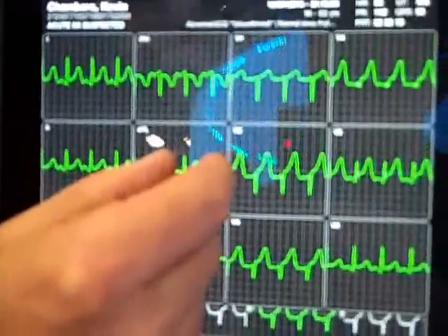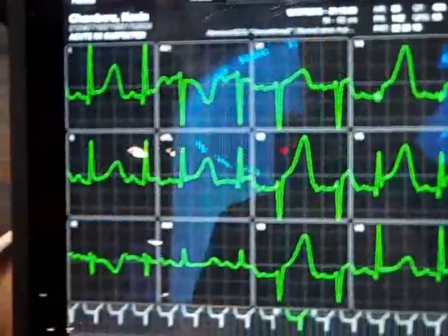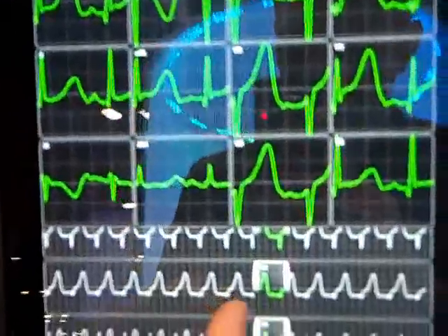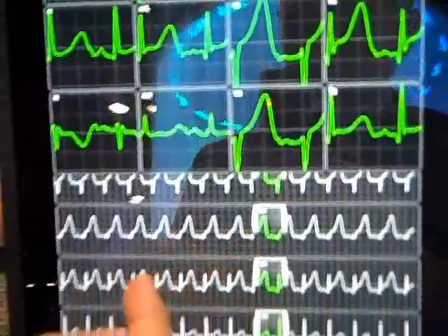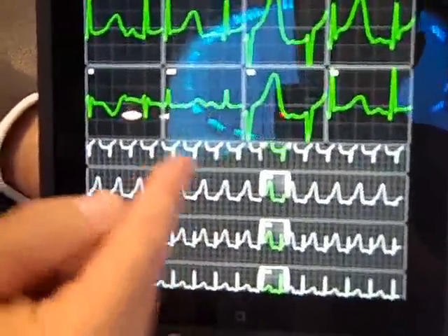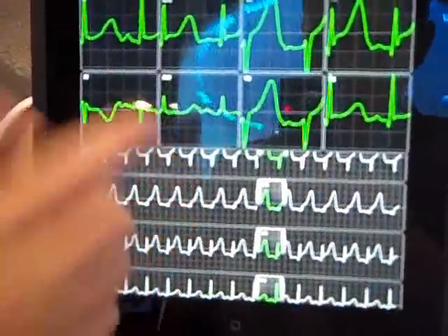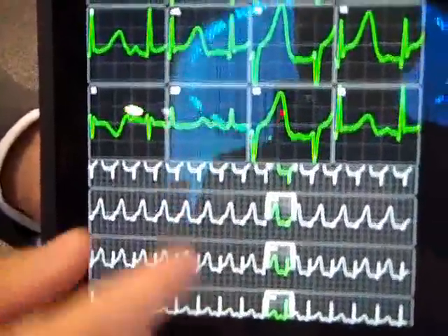You'll notice that as I pinch and zoom, it maintains aspect ratios at all points in time, so I know where I am. This is all FDA cleared.